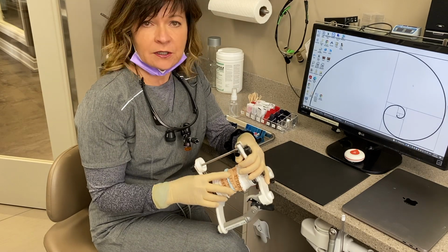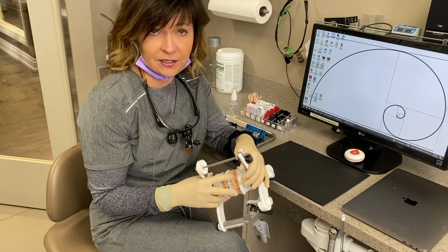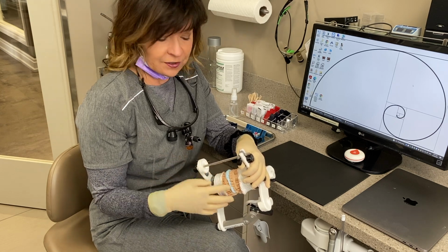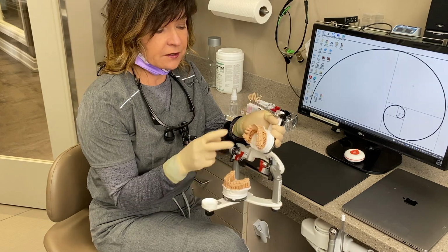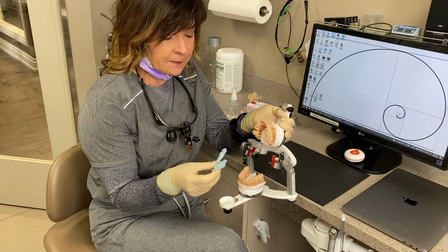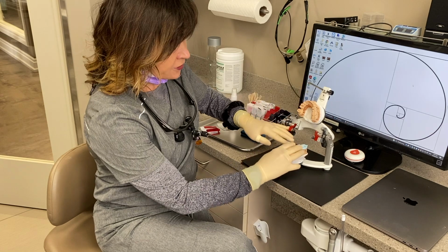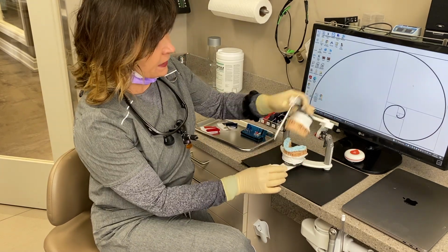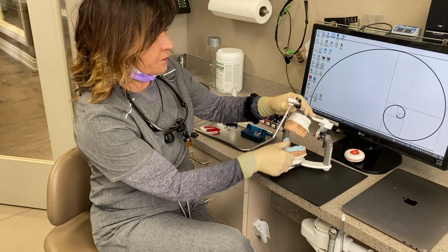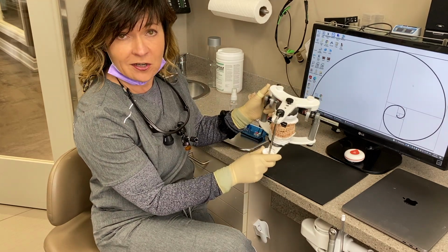So this is typical of patients where I think the bite is contributing, but I'm not quite sure, and I just want to take a look and see what they're doing in their mouth on models. So we do scans of their teeth, we 3D print the models, and then we do different types of registrations of their bite, and essentially mount the models on what's called a dental articulator with this bite. Once everything's set in stone, we can take the bite out and see how this patient looks and where the contacts are in the teeth.